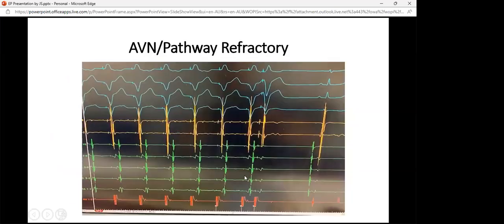And again, just to show you the picture here, we can see it here on this signal. It's not very clear, but you can see that there is a bit of a slant on this CS lead here, suggesting that that CS activation is getting led here from the distal catheter first as it makes its way up to the atrium.